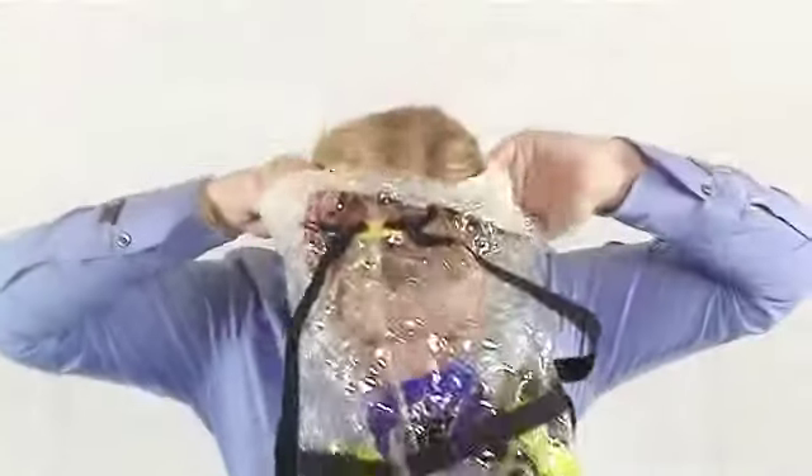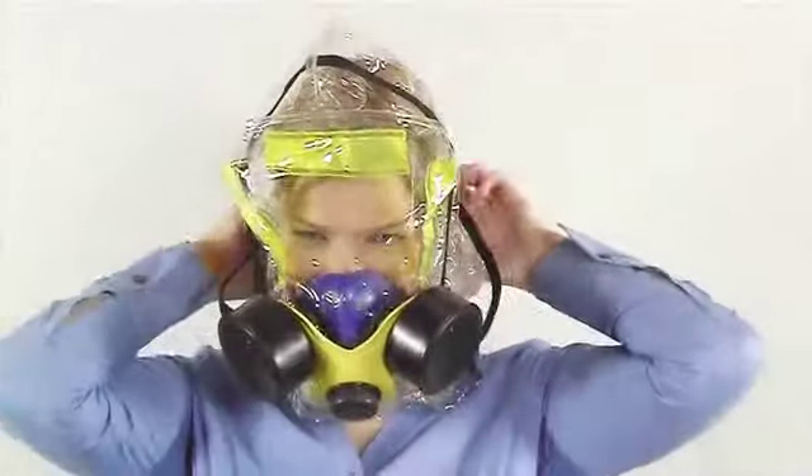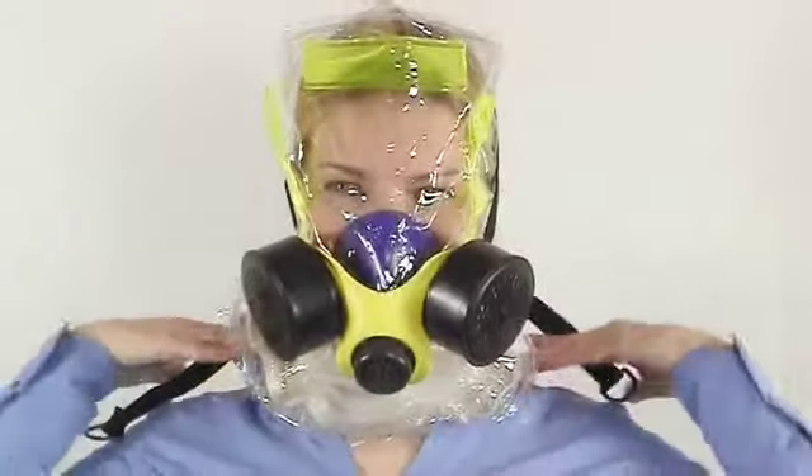Step 4: With the blue cup toward the front, pull the hood over your head and pull the hood opening down to the bottom of your neck. Step 5: Make sure the blue cup is covering your nose and mouth and fits under your chin.